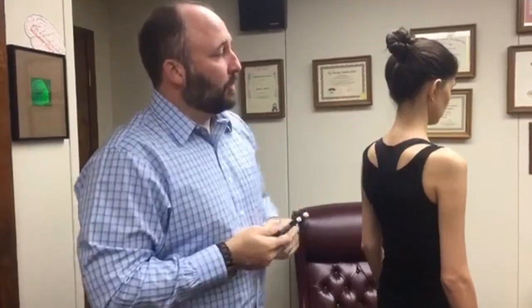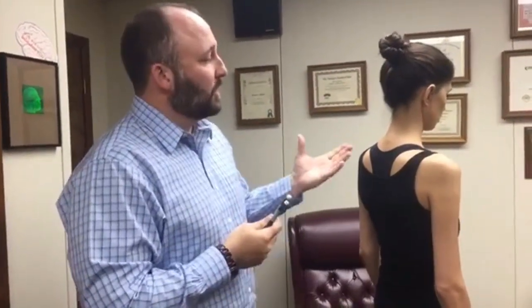So that's our shoulder and neck protocols. Once we're done, ask how they're doing, have them move around, check range of motion, and re-evaluate their pain on a scale of zero to ten — a quick, easy way to track improvement as we treat. Then we'd have Rachel put on the ear clips and do 20 minutes of CES. That would top her off if she has any trouble sleeping or is depressed due to chronic pain. CES can help with that — it's a good combination to add to our pain protocols.